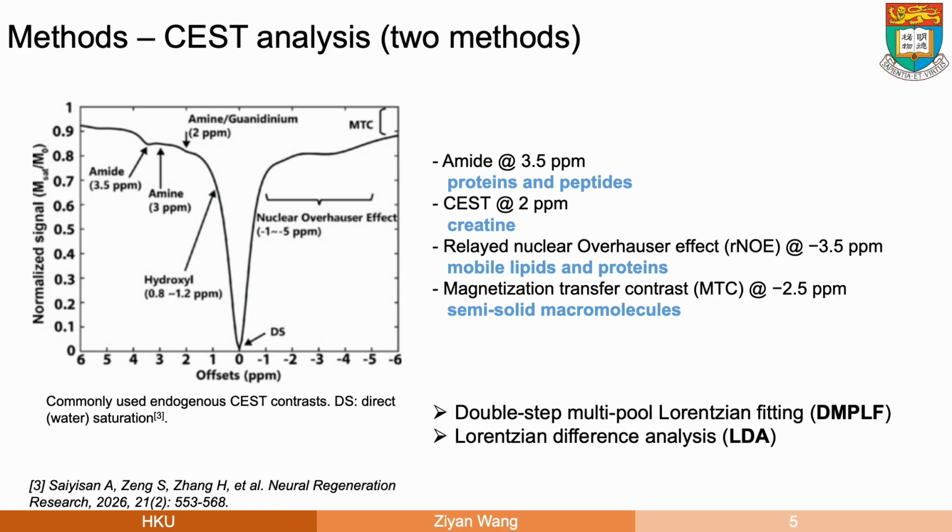Two analysis methods were used here, including our recently developed double-step multipool Lorentzian fitting and Lorentzian difference analysis.